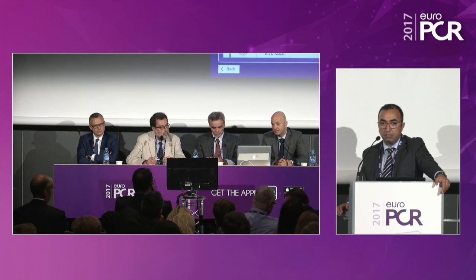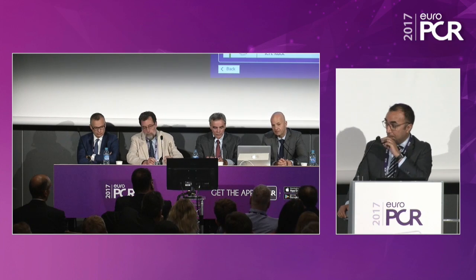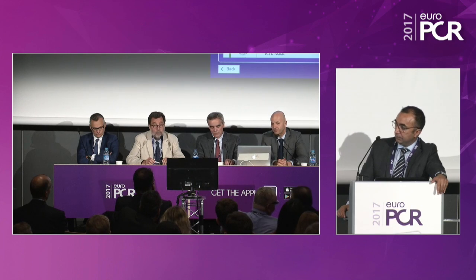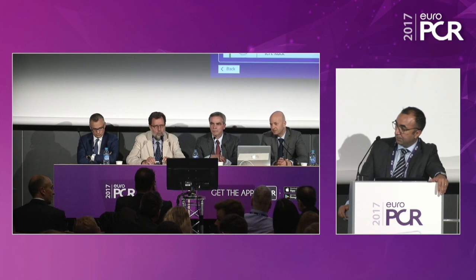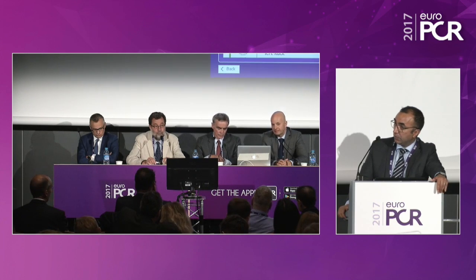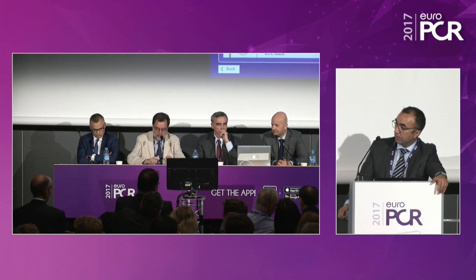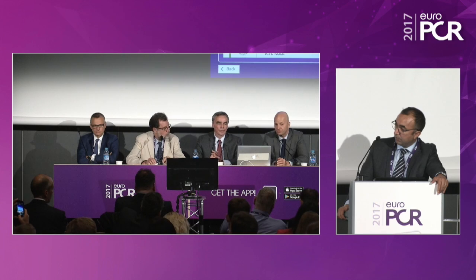Another issue is patient selection. We also were very cautious in the patient selection within this trial so far, which we have to be, because we have to control the situation up front. It's about feasibility so far. So these are two major issues. And another issue is if you talk about asymmetrical patients, so the typical ischemic heart mitral regurgitation patient, we may also end up with some issues if we have severe tethering on the posterior mitral leaflet. So we have to sort this out in future studies.